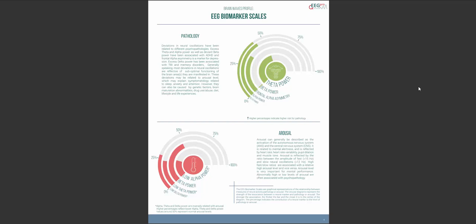The bottom graph shows the arousal scales. Generally speaking, high arousal is associated with high power in higher frequency bands such as beta and gamma and lower power in lower frequency bands such as alpha, theta and delta. For low arousal, it's the other way around.